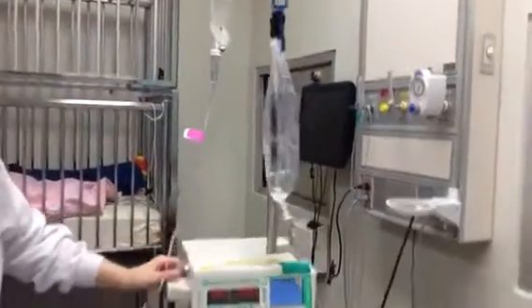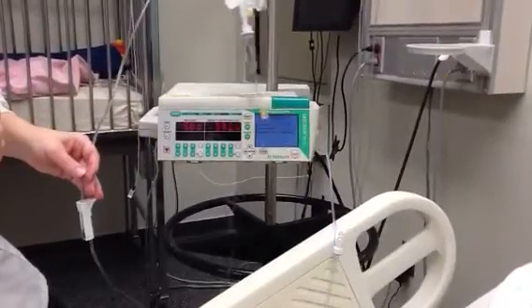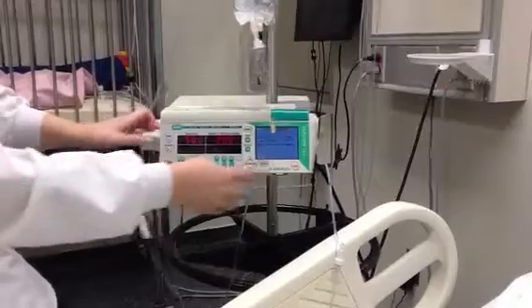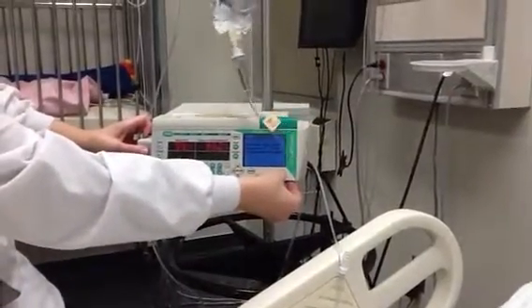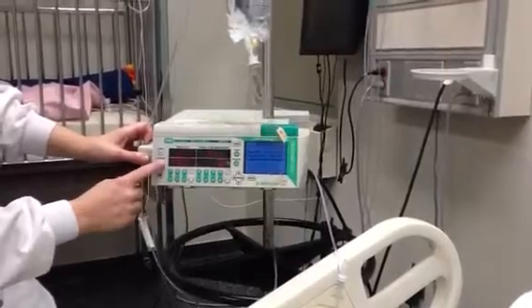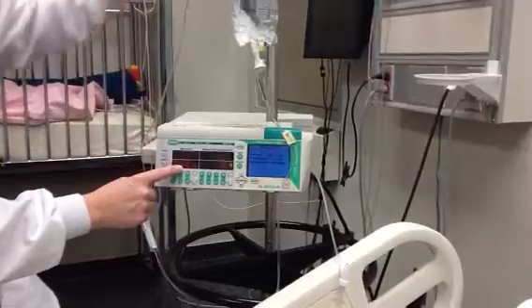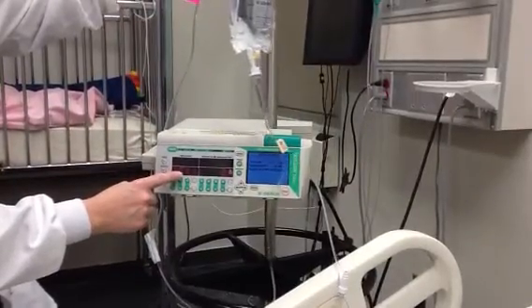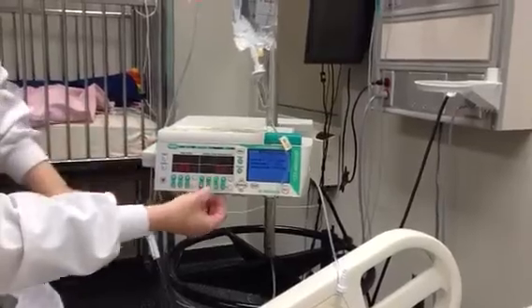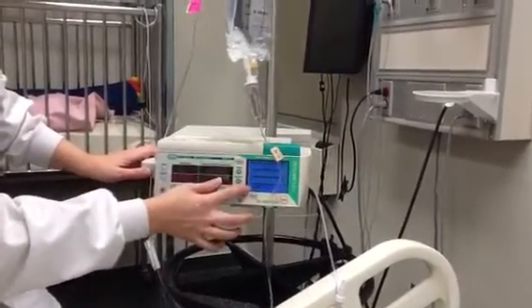And so now, this would be a continuation from the first part of the secondary tubing, the secondary medication, where we're now going to program the pump. So we would put it on hold, connect to the piggyback. It was already set from the last person for 150 milliliters per hour, but we would verify that that's the order we have. And then we would input our volume to be delivered to 50, press piggyback run, and follow the directions.